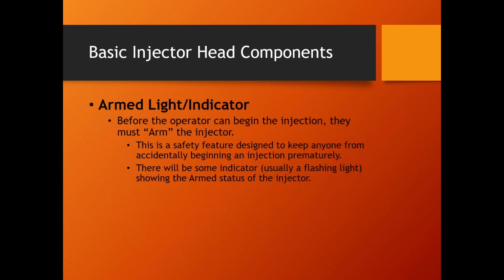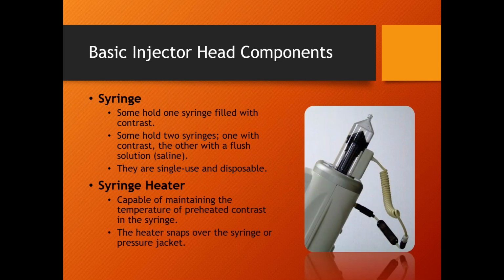Armed lights and indicators. Whenever we do an injection, on my injector here, I have a contrast syringe and a saline syringe. Saline is basically saltwater. Contrast is the magic fluid. Now, on my injectors, I can select multiple shots for each injection. They're referred to as phases.